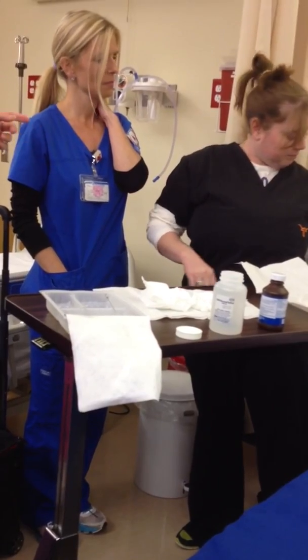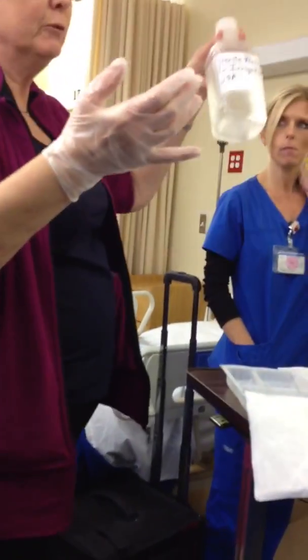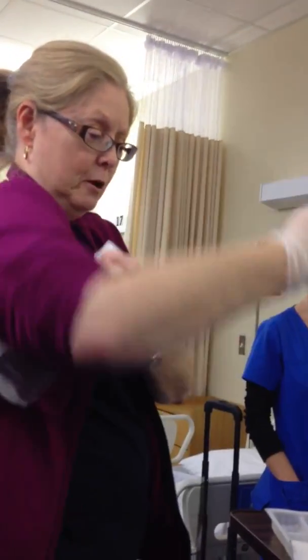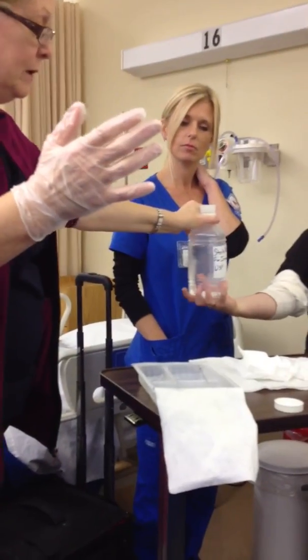Hand me that bottle of sterile water right behind you. If this happens to you and you forget to undo your caps, just remember, all is not lost. Just hold it on here and undo it, okay? Where there's a will, there's a way.